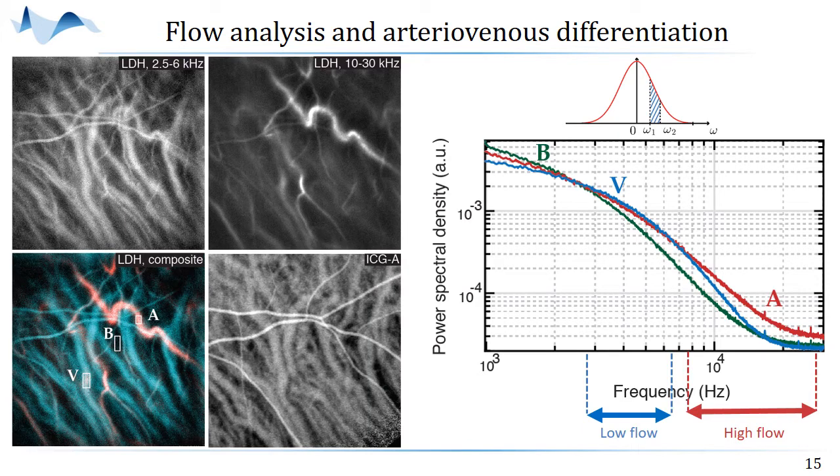So with ICG, this is the venous timing, so we are sure that only the choroidal veins are revealed, and these are the vessels that you see in blue with laser Doppler, and the vessels that you see in red with laser Doppler, which are the arteries, you cannot see with the ICG angiogram.